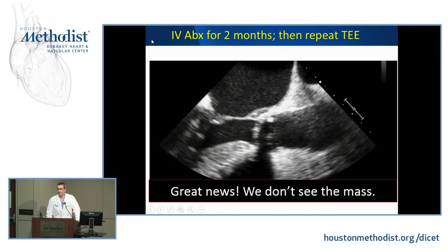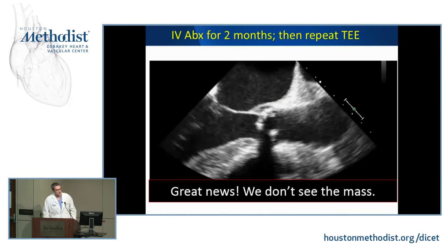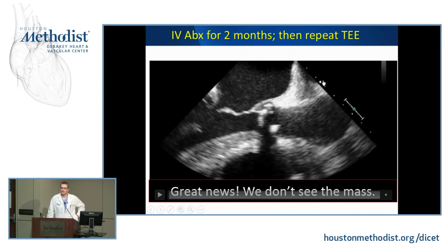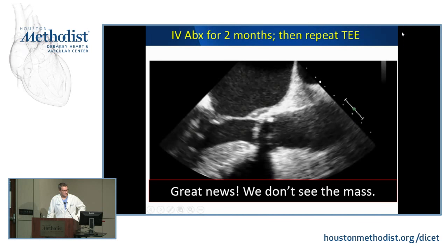So he was treated with antibiotics for 2 months. And now you don't see the mass anymore, so it seems like terrific success. This maybe is like the other case. Maybe we're going to get away without surgery. Any concerns on this echo?